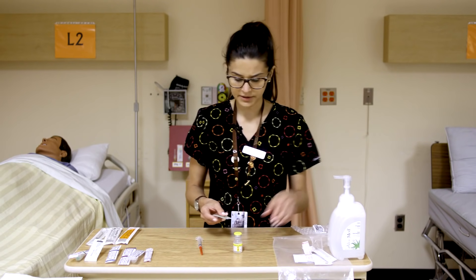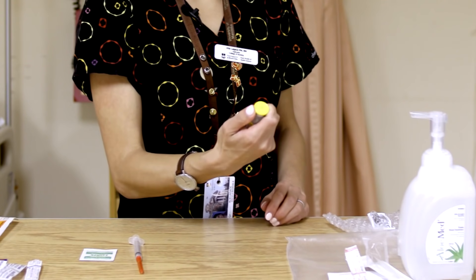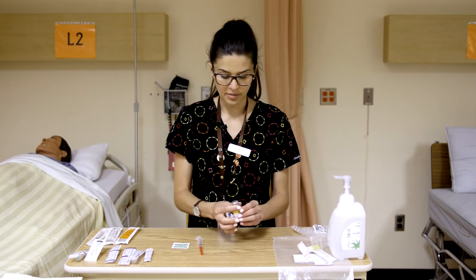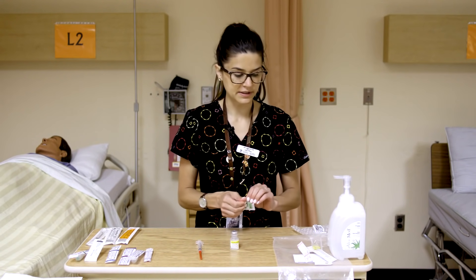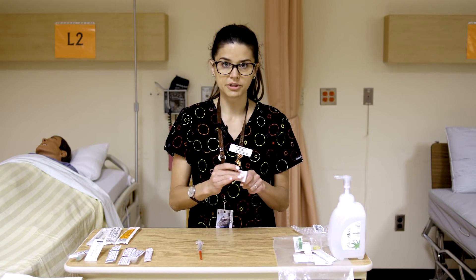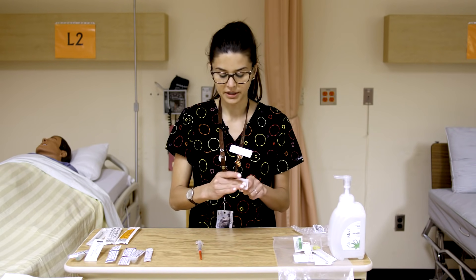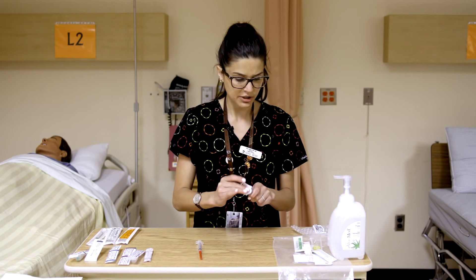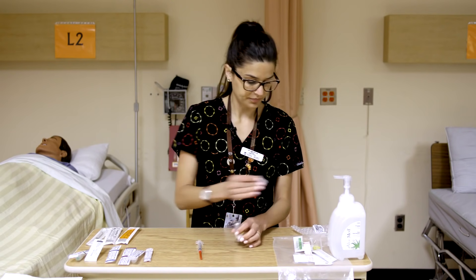Next, take an alcohol swab and pop the top off the vial by sticking your nail or thumb underneath — you'll hear it crack and then lift it off. They are said to be sterile under there, but it's not a guarantee, so it's best to always clean this rubber stopper first. Clean it in a circular motion with some pressure for about 30 seconds, and let it dry. You want to make sure you're not inadvertently introducing any microorganisms into your syringe.